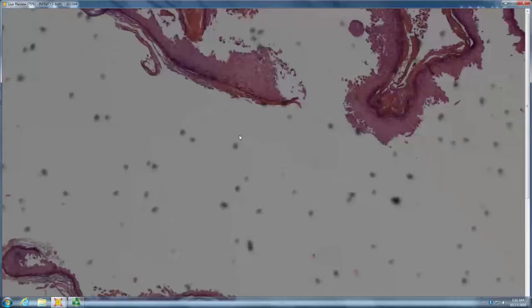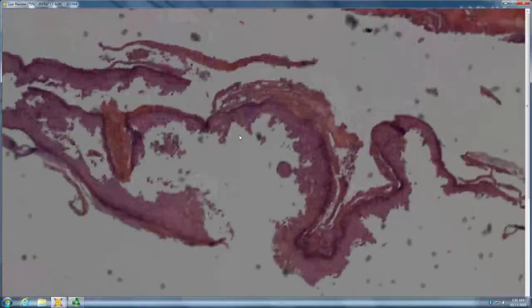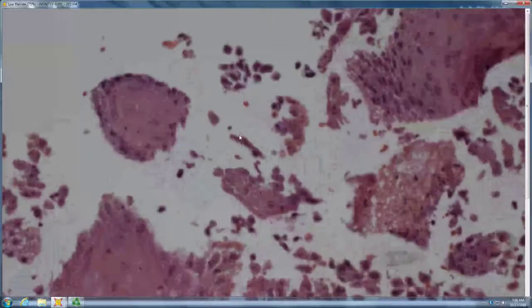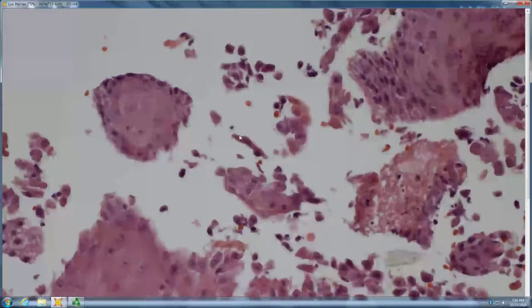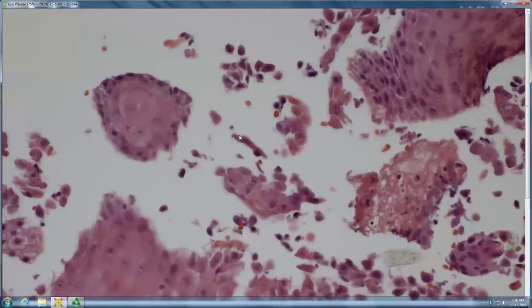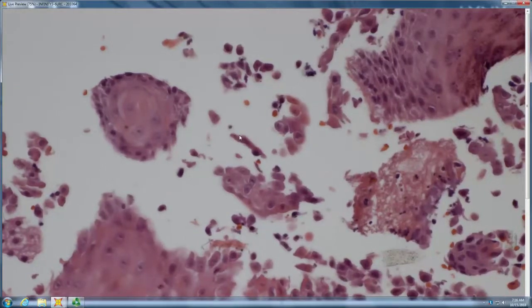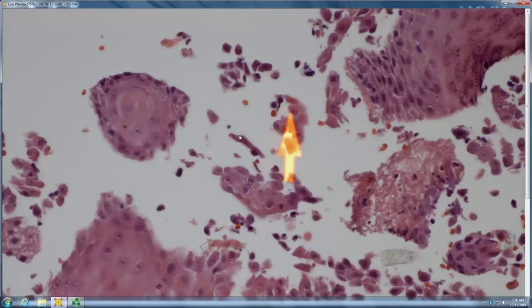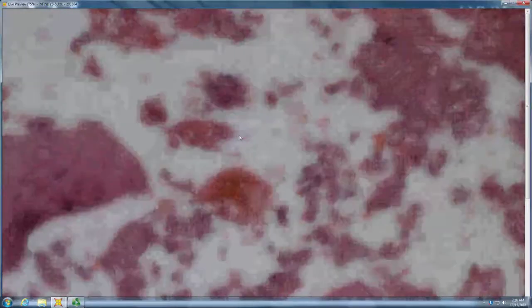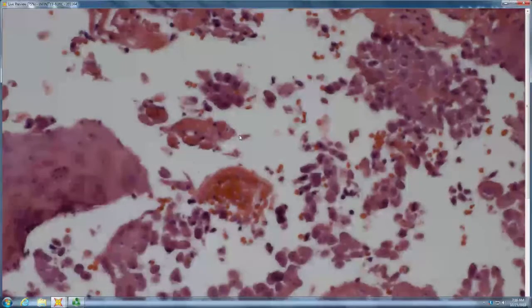Beth, you want to start? You have some acantholysis too. Is it restricted to acantholysis? Are the cells otherwise normal besides being acantholytic? So you have dyskeratosis, and tell me about the color of the rings around the nucleus. They look mostly red. Yeah, mostly red, one might say only red.